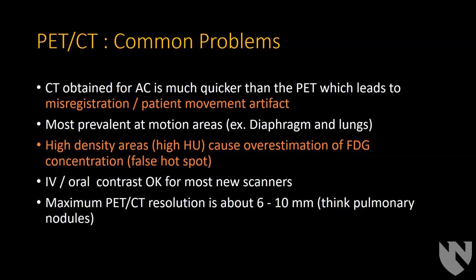IV and oral contrast, theoretically, if that was present when you did the CT, but then it moves, that could cause artifact. However, with most newer scanners, that does not cause artifact. And so IV and oral contrast are pretty much okay.